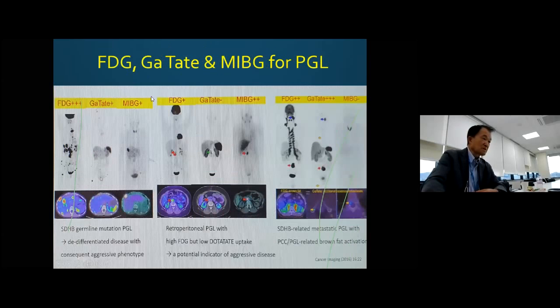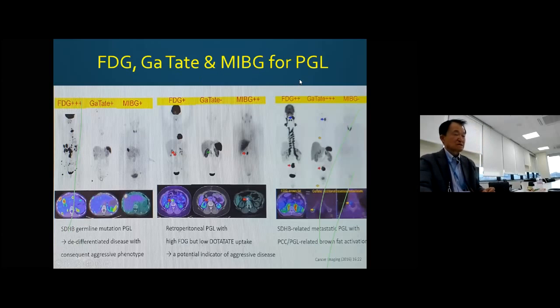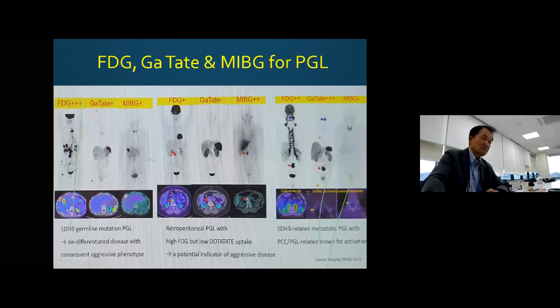And then some compared things of paraganglioma. It's unusual to have this kind of intensity with FDG in most paraganglioma initially, but when this well-differentiated tumor becomes anaplastic, de-differentiated, then you expect this kind of thing. And the more specific MIBG or DOTATATE show some, but these are better with well-differentiated cancer.